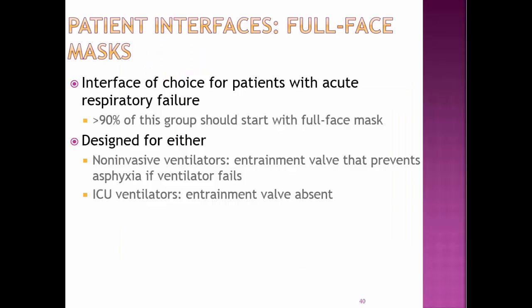The full face mask, this is kind of a confusing name because this one doesn't cover the entire face like what the name implies. It just covers the mouth and nose. This is the interface of choice for patients with acute respiratory failure. More than 90% of this group should start with a full face mask. It's designed for either non-invasive ventilators or ICU ventilators.